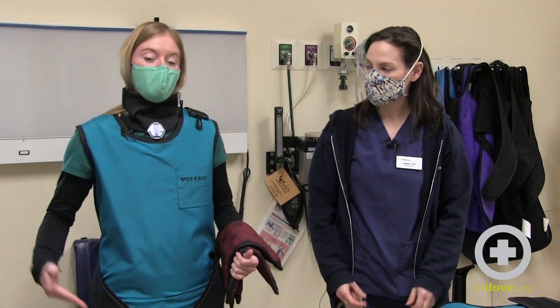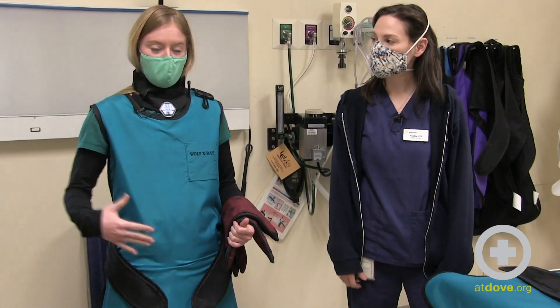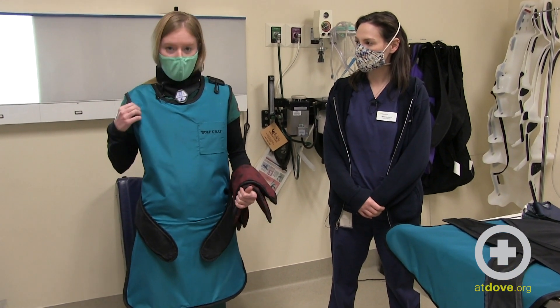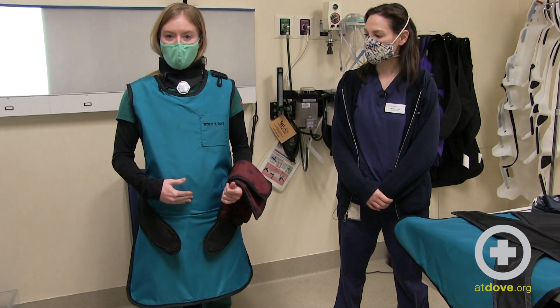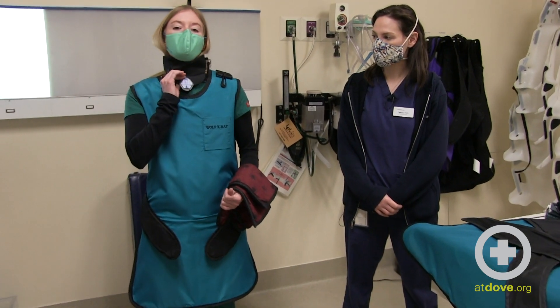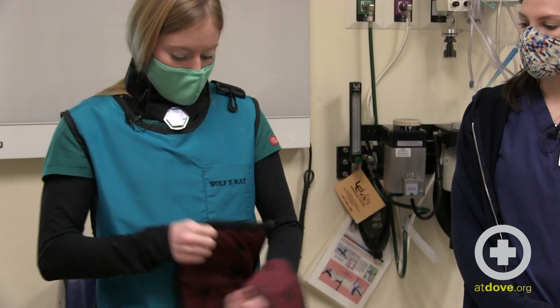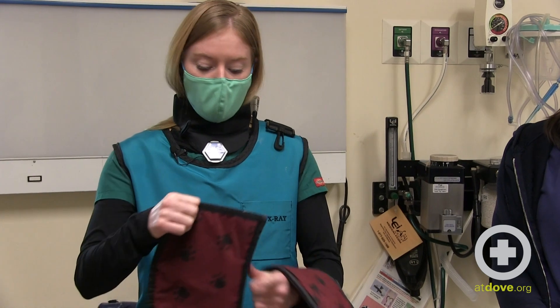I'm already wearing most of my personal protective equipment. I have an apron here which is lead-lined, and I'm wearing a thyroid shield which is also lead-lined that is protecting my thyroid. What I don't have on yet, but will put on before taking any radiographs, are lead gloves.